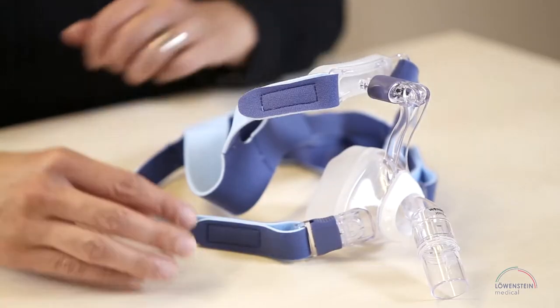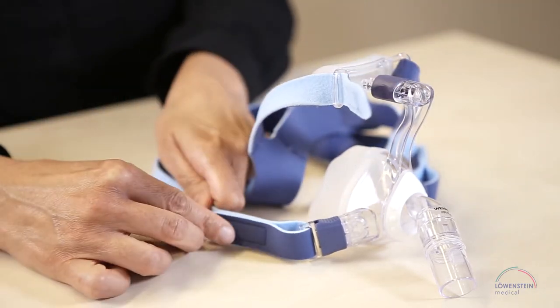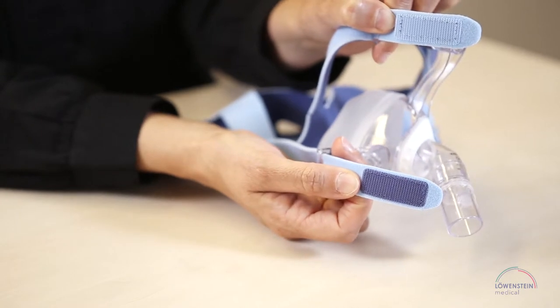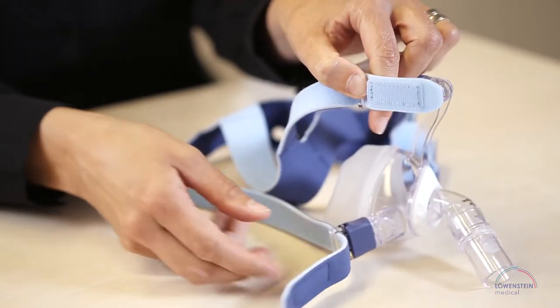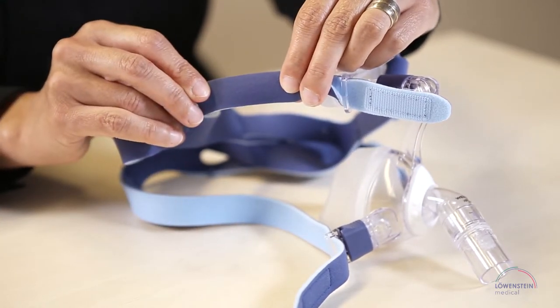The color coding on the hook and loop fasteners helps you to identify the upper and lower parts. The upper tabs are light blue like the sky and the lower tabs are dark blue like the ocean. Outside the straps are light blue and inside dark blue.